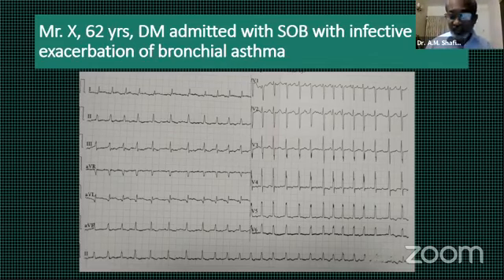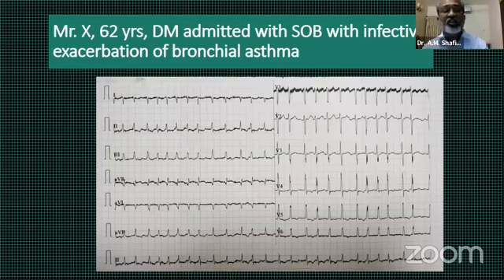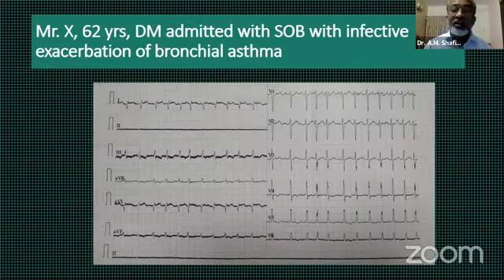But actually, the problem is that I could not interpret this ECG. That is why I deliberately asked the sisters to bring the ECG machine, and I did different combinations to get this sort of ECG. Later on, I could find that right arm and right leg displacement can give this ECG. That is how I could discover. And this is the problem. It has happened. So we need to know whenever we want to interpret these sorts of ECG.